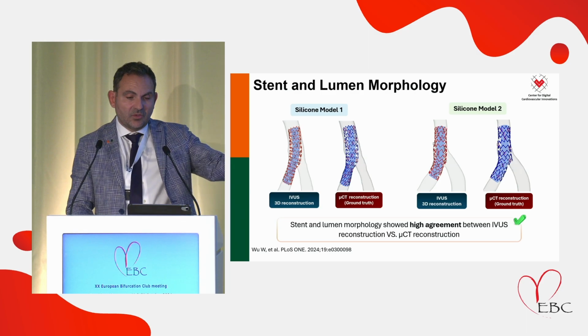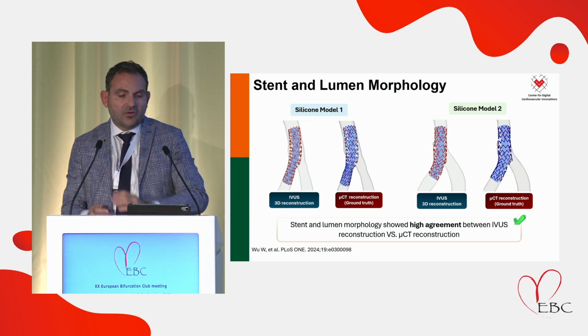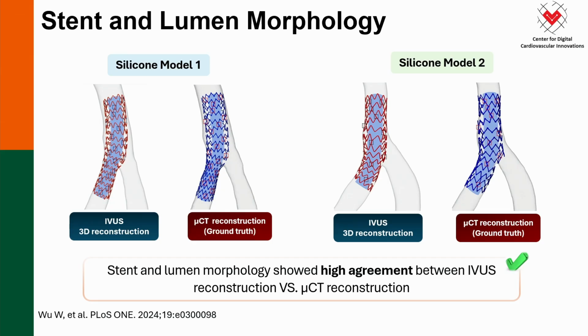On the left, model 1 is IVUS reconstruction, our technique. On the right is the ground truth. Then on the far right, silicon model 2, again, 3D IVUS and micro-CT as ground truth. You see visually they look pretty comparable.